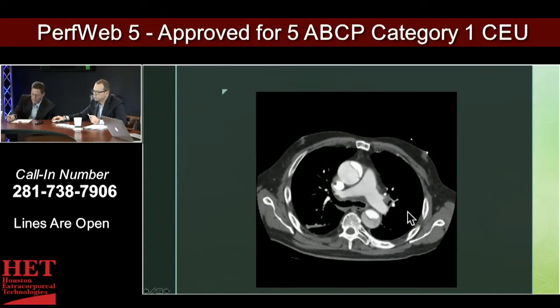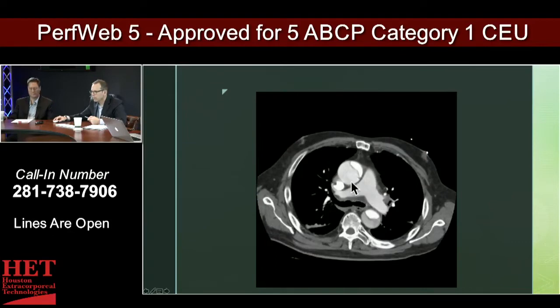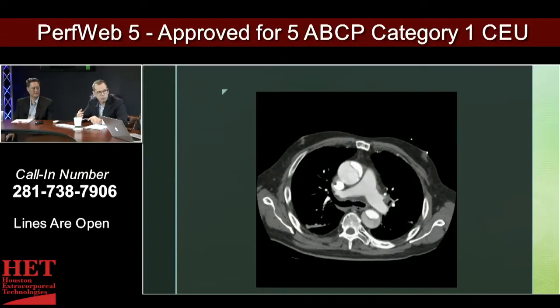That area of the superior vena cava — why is that? The dissection is not in there. This is the contrast bolus. When they give contrast it's always given IV through a peripheral or central line, injected into the venous side, then it'll go through to the PA, back through the lungs, to the heart, and out the aorta. That's why it becomes important for a gated CT to be appropriately timed to the proper phase — you can get venous phase or arterial phase, and if you're looking for a pulmonary AVM that would be a reason to get both.